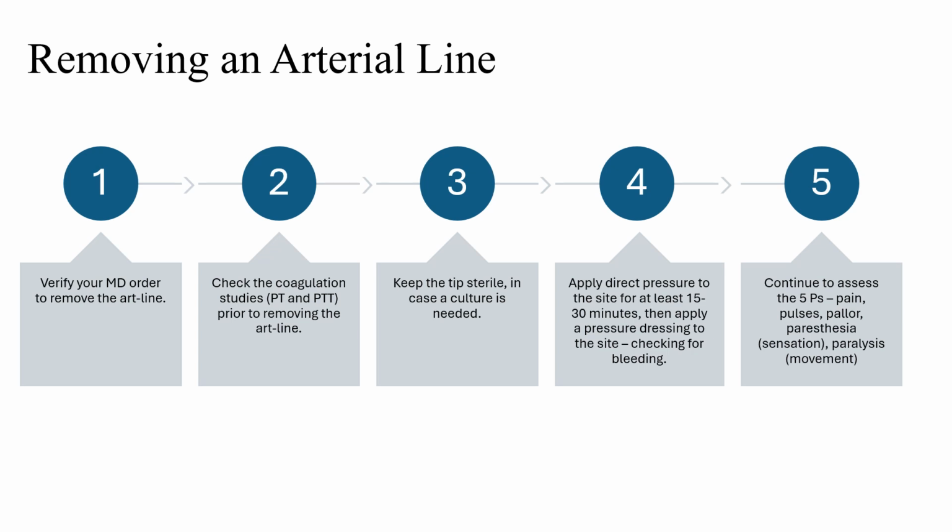You want to make sure that you keep the tip sterile when you remove it in case it needs to be cultured. And then as you remove it, you need to apply direct pressure to the site for at least 15 to 30 minutes. And then after that, you're going to apply a pressure dressing. And you always want to check for bleeding.